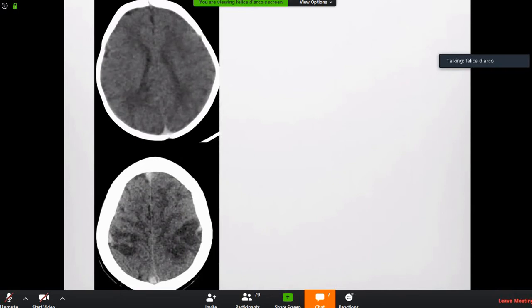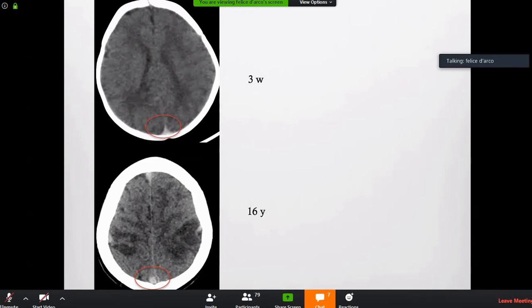The density is very similar in both cases, so this could be thrombosis. The first thing to look at is the shape of the sinus — in one case it is a bit round, in the other it maintains a tent-like shape. However, don't rely too much on these subtleties in CT or MR, because they can fool you.